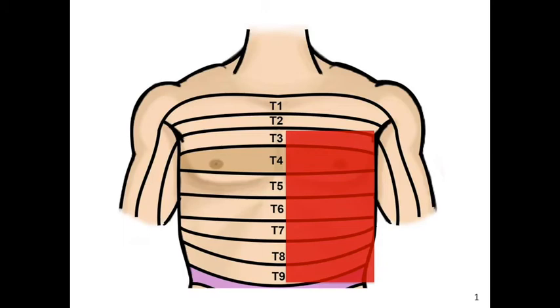The serratus anterior block can provide anesthesia for the anterior and lateral hemithorax. The dermatomes T3 through T9 can be affected by this block, as shown here in the diagram. The serratus block targets the intercostal nerves as well as the long thoracic and thoracodorsal nerves, all of which run within the fascial plane where anesthetic is deposited.